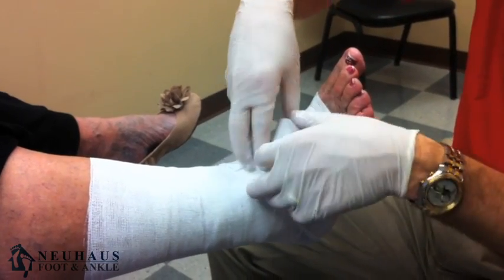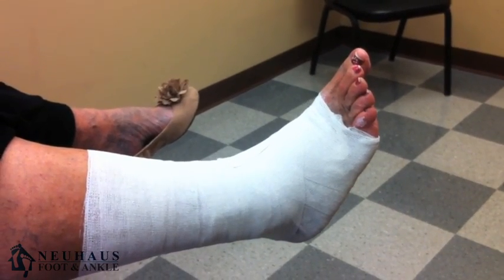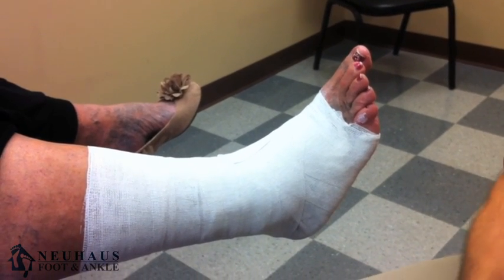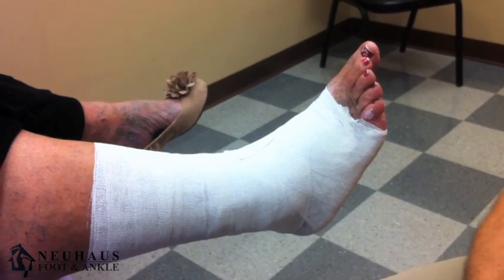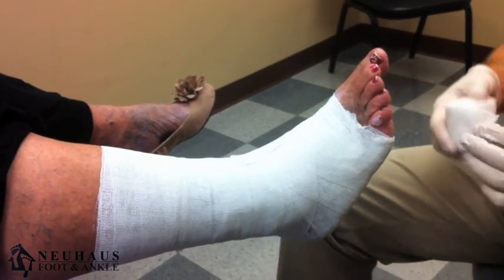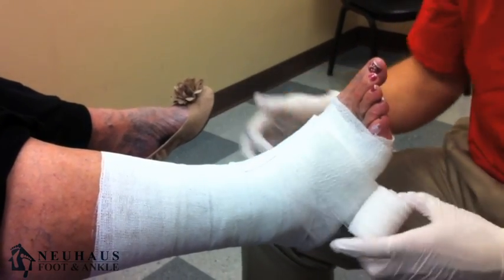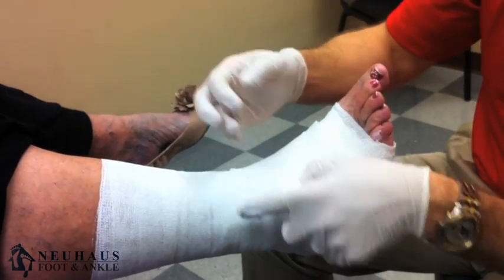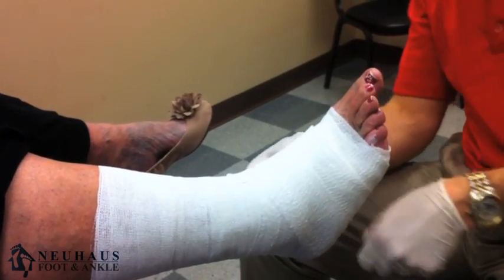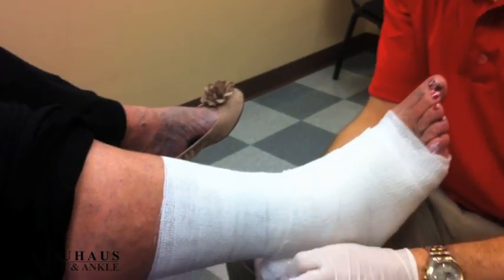I think this wound has actually gone on to heal very nicely, shrinking up a little bit every day. You can see that the wrap goes on very easily. It is very, very moist — it does not dry up like a normal cast would, though I do call it a cast. We put some extra gauze on over the top because it's real wet and can make a mess on the floor in your shoe. It's not going to harden up; it's going to stay flexible, but it certainly does minimize the motion across the area.